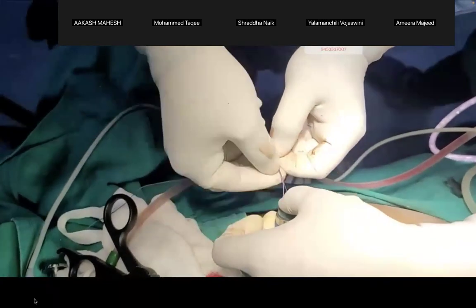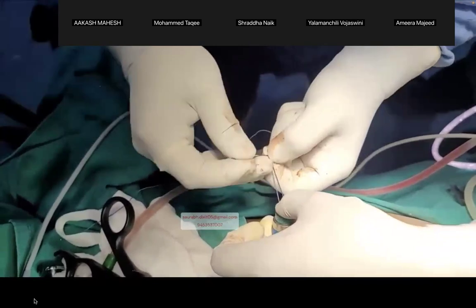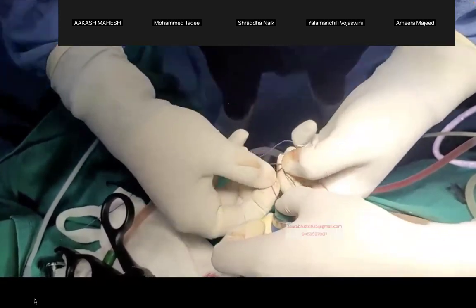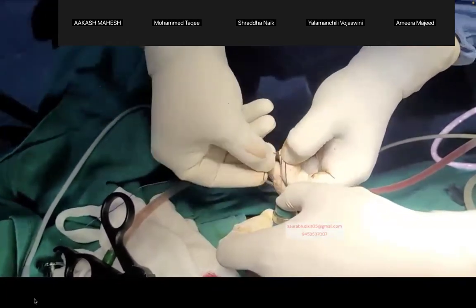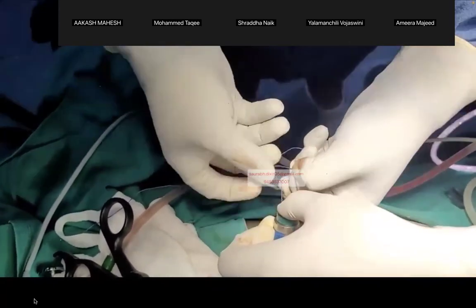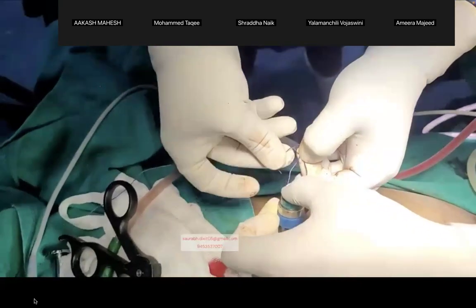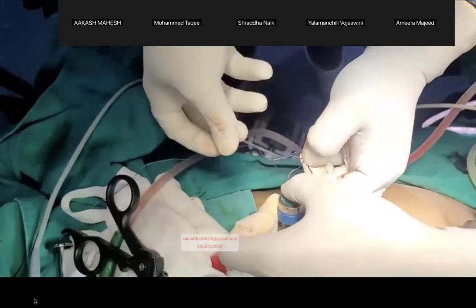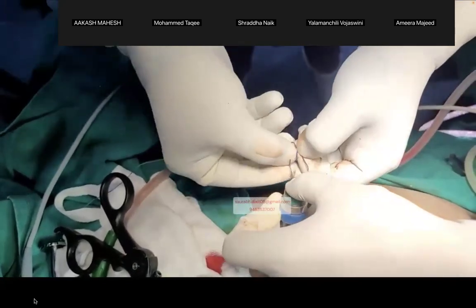So this is configuration of 2 and 2 now. Now the last step is I will do 2 locks also. So 2 winds, 2 hitches and 2 locks. And that is why this knot is 2, 2, 2. You can also say a modified Roeder's knot or anything, but I call it SD's knot because I am the one who uses this. Apart from me, now my students are using. So you can see I have created a knot.